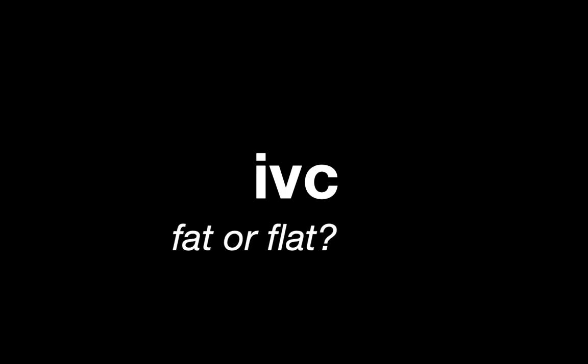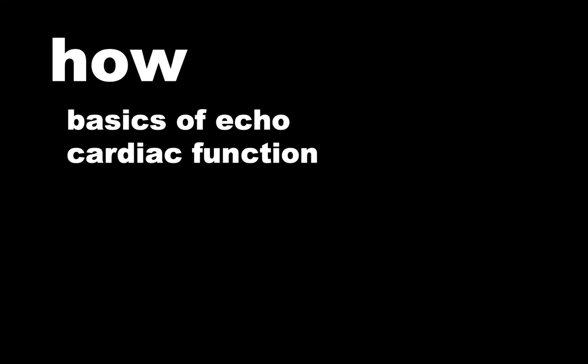So that is the IVC. Remember to ask yourself, is it fat or is it flat? And know that there's a lot of drama surrounding the IVC, but that it may still have some clinical utility. So that's basically it. We talked about the how, the 4 basic views of the echocardiogram. We talked about cardiac function and how our job in the ED is again to tease out if the function is normal, reduced, or hyperdynamic.